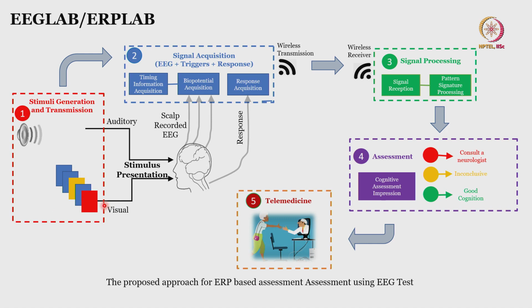How many electrodes have been used? You can see here 3 electrodes have been used, which are generally placed on CZ, PZ and OZ, because this is a visual experiment. I have already discussed that for a visual experiment your electrodes should be placed at the back, either central or occipital or parietal region. Okay. So today the focus is more on code.